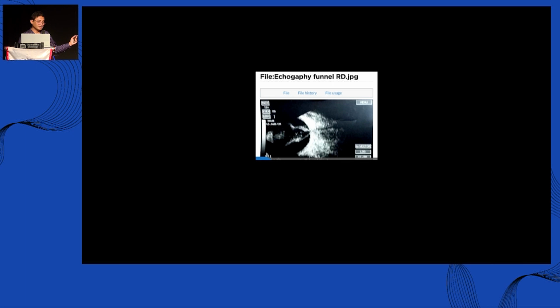Now you can see the RD is usually attached at the optic disc. So you know there could be RD. But sometimes you might miss it with the PVD. If you do it carefully, you can see there's a free end, not attached to the optic nerve. And in PVD, what happens? When you keep reducing the gain, at one point, the shape is lost. You don't see the shape. Then you know it's a PVD. That's how you differentiate between RD and a PVD.